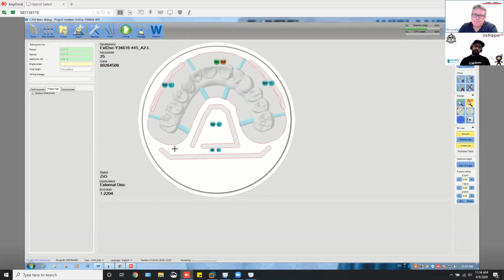Cut these off, and then after the braces, it's kind of hard to see this. And it took me a few times to understand, but what you guys are looking at is this white part is going to be the brace. Yeah. This gray is going to be cut out, and this gray is going to be cut here. And what I'll do is I'll actually end up cutting this out. So this whole center piece will be gray. And then I'll come here and cut here and cut here. And then basically this whole white thing with these 4 sprues will be my base.